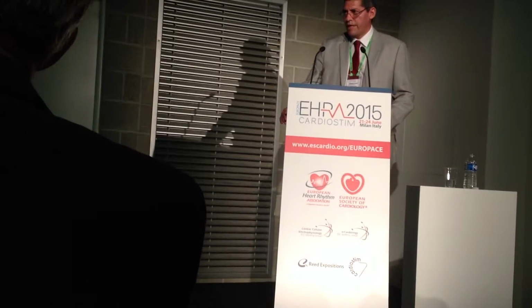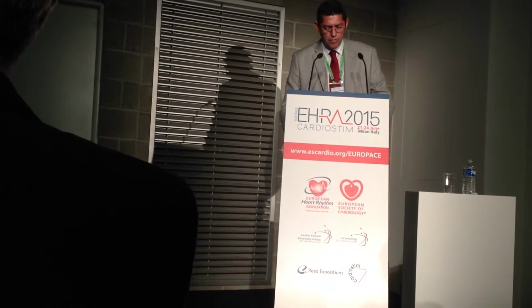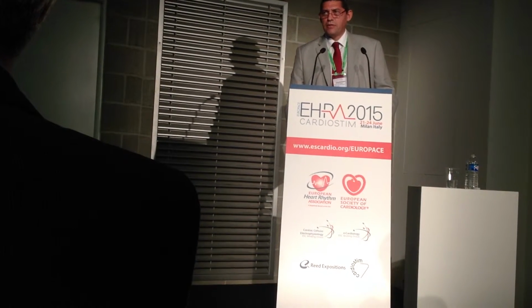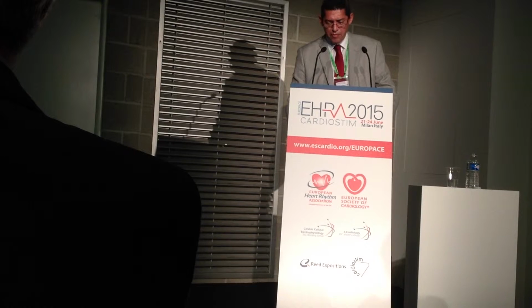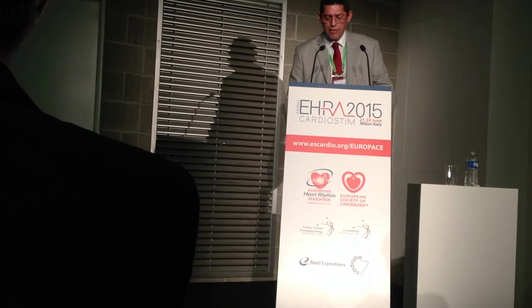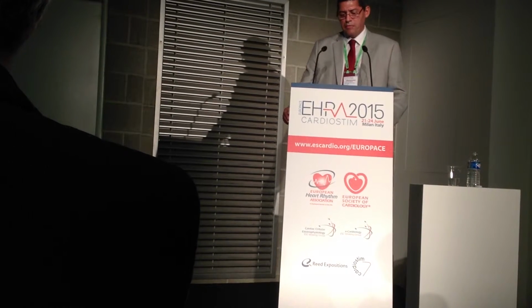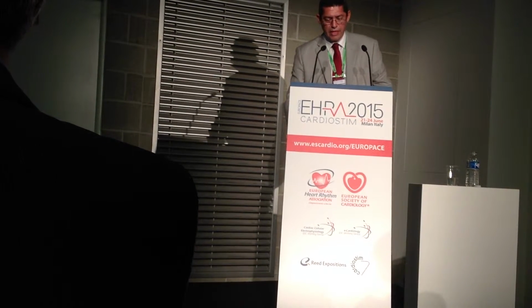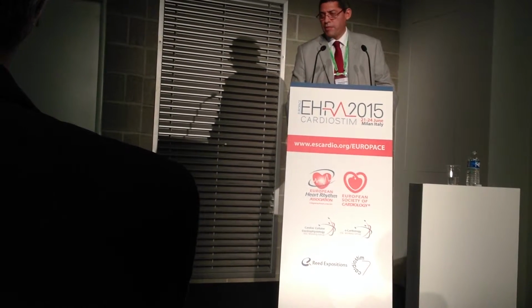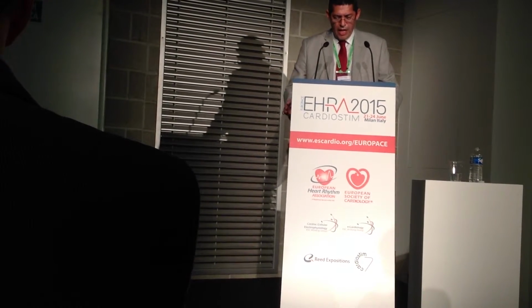Well, what about failed ablation? In this very important publication from Dr. Morales' group, they included patients with RVOT-like ventricular arrhythmias and failed ablation, and they found that in 74% of the patients, the arrhythmia origin was not in the RVOT, and the most likely explanation for the failed ablation was imprecise mapping. Due to that, they proposed a step-by-step approach in these patients. First, perform a careful RVOT mapping, then pulmonary artery mapping, then coronary venous system mapping to evaluate the epicardial origin, and finally, the aortic cusp.